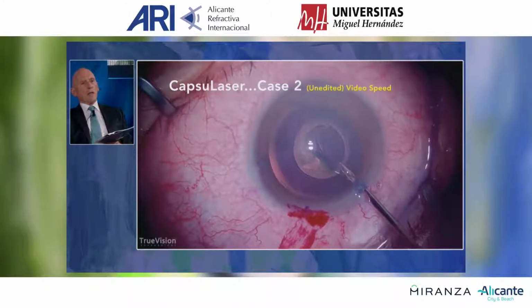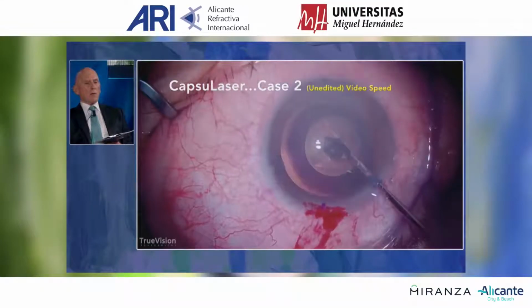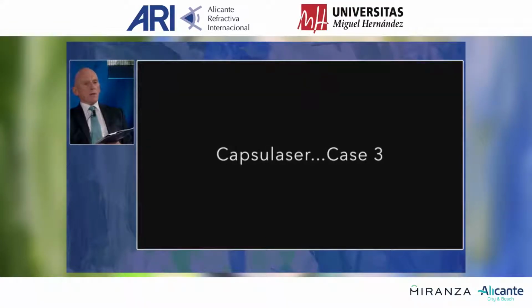And you see again how much free floating this capsule is, how totally detached, and how precise, rounded and elegant this capsulorhexis is.